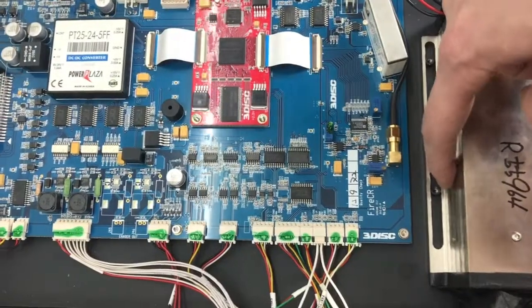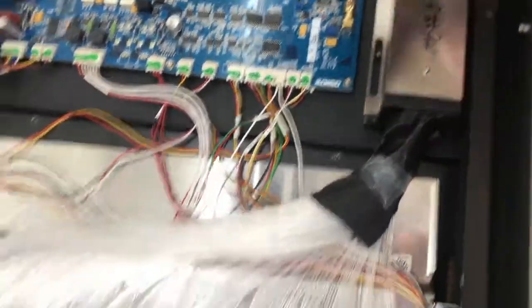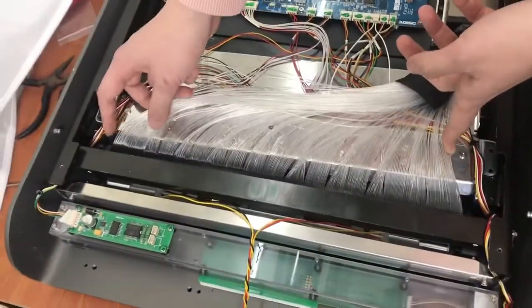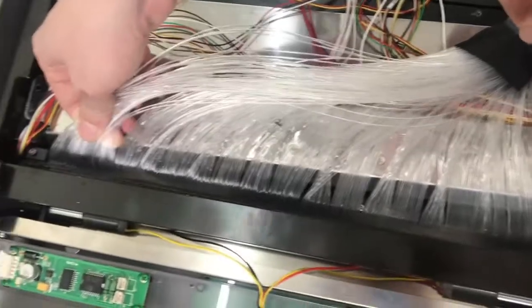There are also two screws fixing this PMT. Let's take them off. Then, just kindly — I mean softly — touch this bundle.